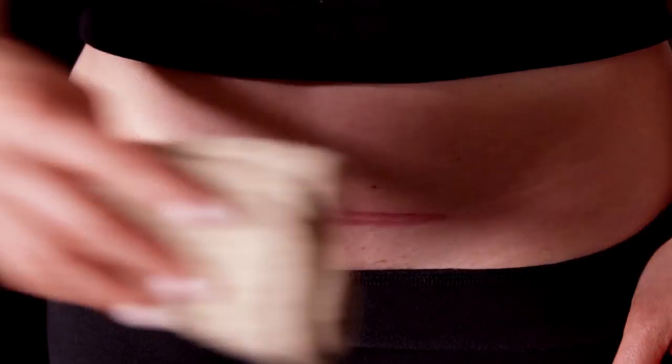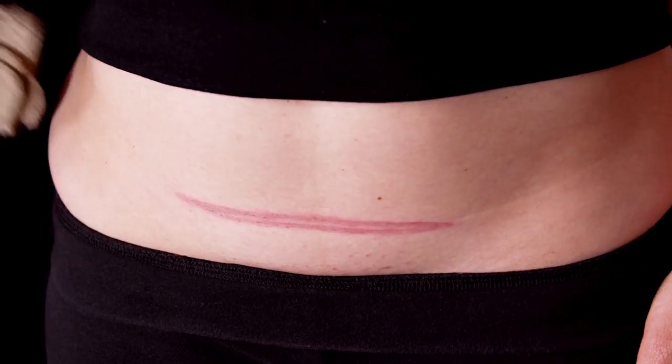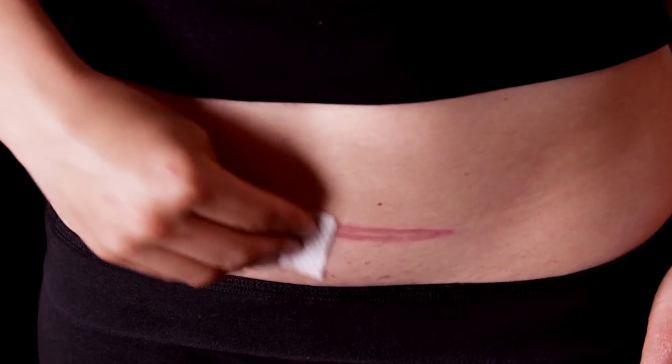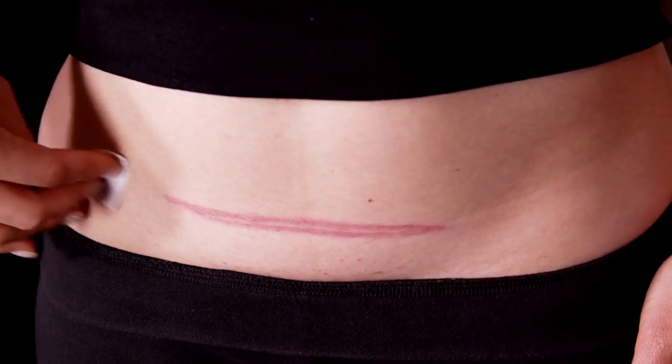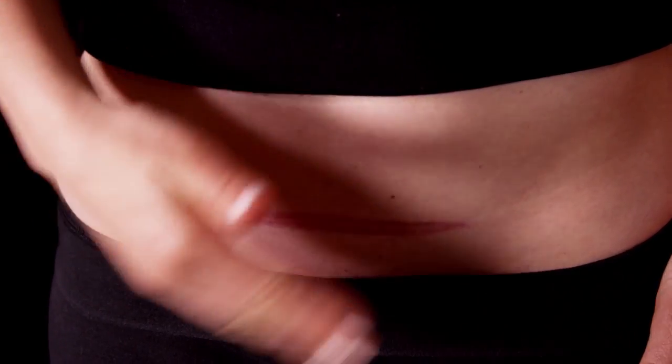Gently cleanse the area surrounding the scar with a washcloth, soap, and water. Next, remove any oil or soap residue with alcohol wipes. Be sure to allow your skin to dry before applying Embrace.